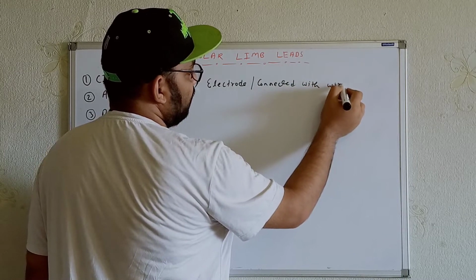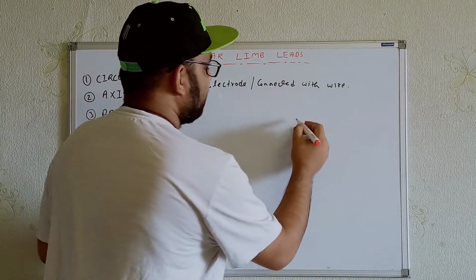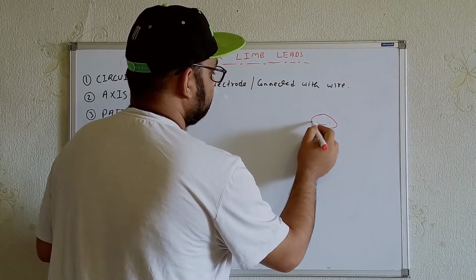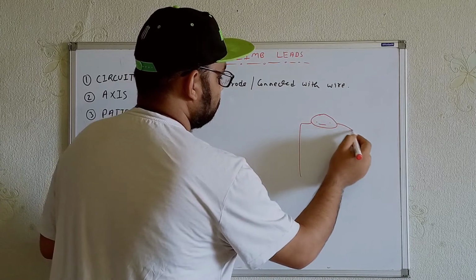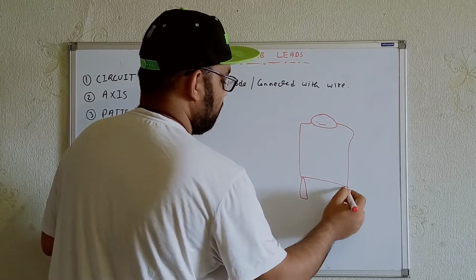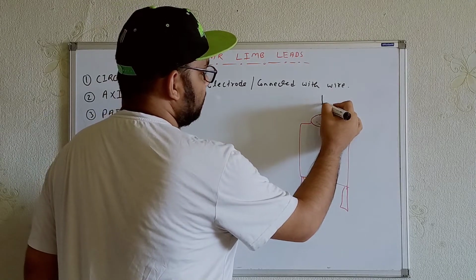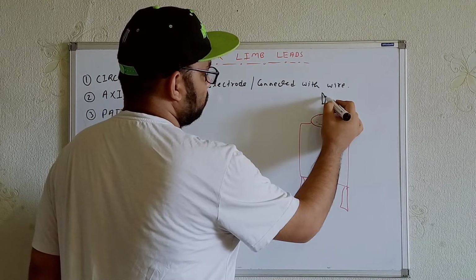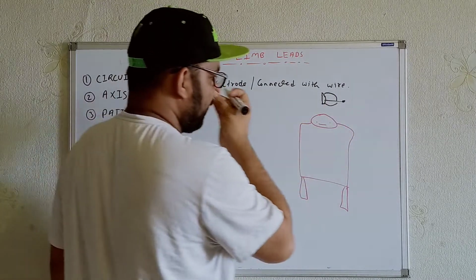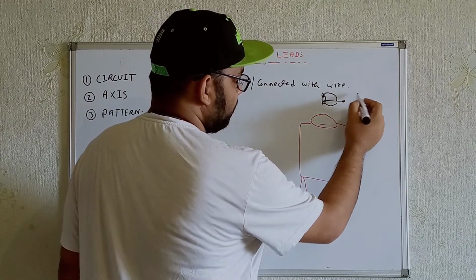For example, I'm just considering this individual hypothetically. Let's see what is laid over here first. There is an ECG machine, the galvanometer, and it has two electrodes just like this. And we know that there is ECG paper.